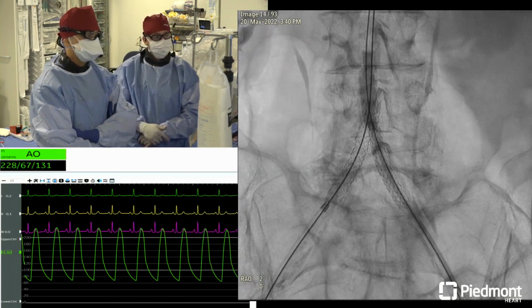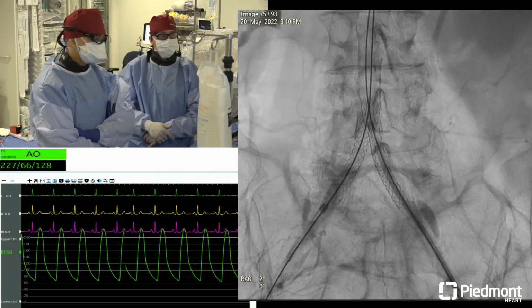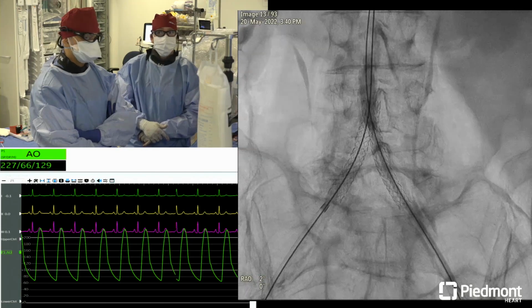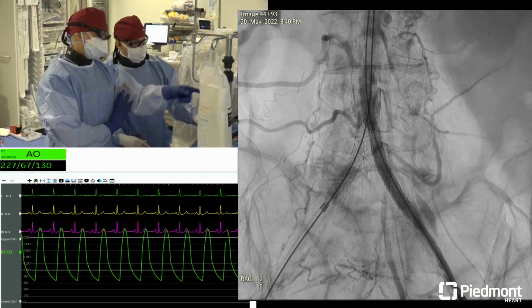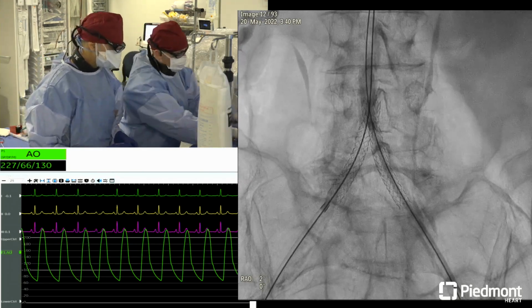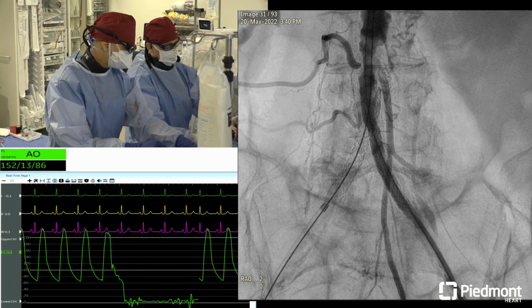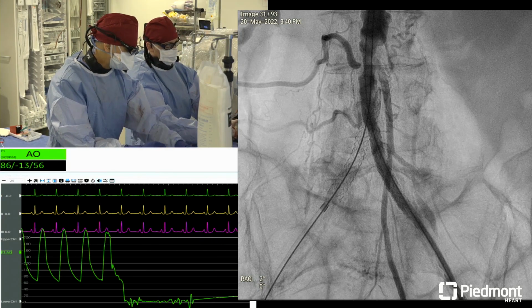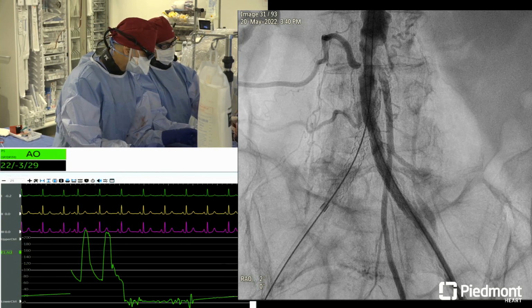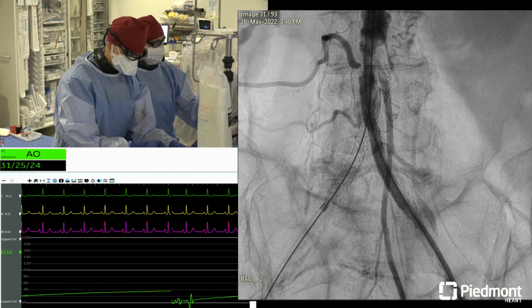Dr. Alt, surveillance post peripheral intervention with imaging, or is it just all clinical assessment? Well, often the patients are going to know first, so if they're the kind of patients that are going to keep in touch with you, I think you can go with that. Otherwise, you can get imaging-guided routine Dopplers. What about the rest of the panelists? One sec, wait, let me flush. I would just do clinical follow-up, and if they don't have symptoms, I don't bother checking.